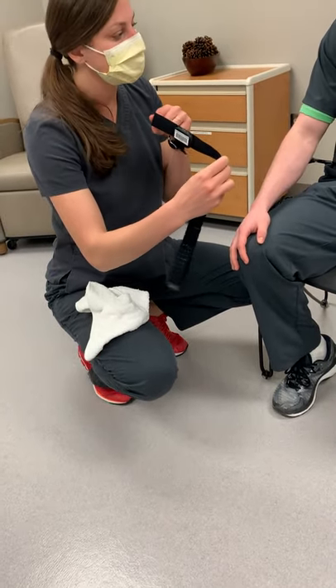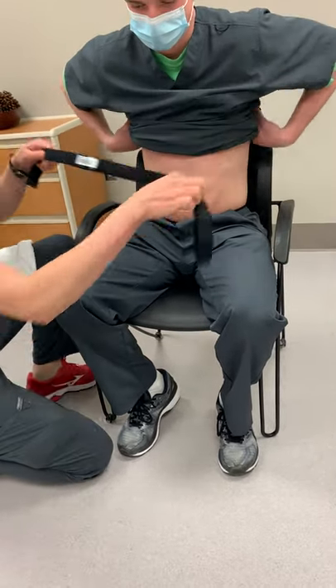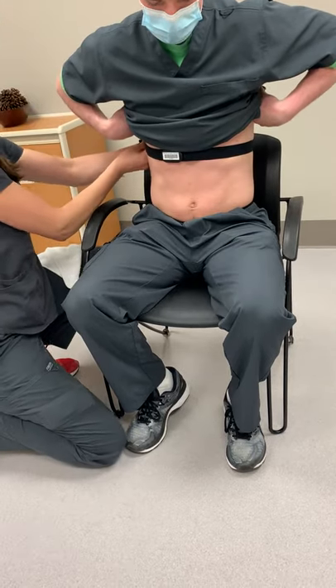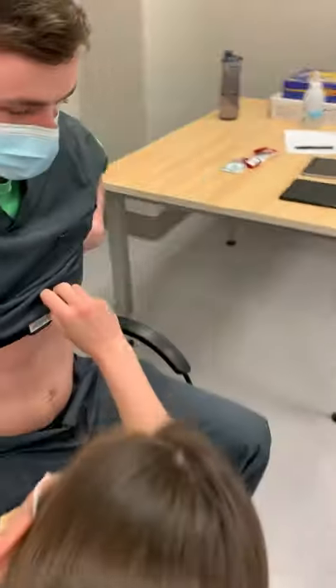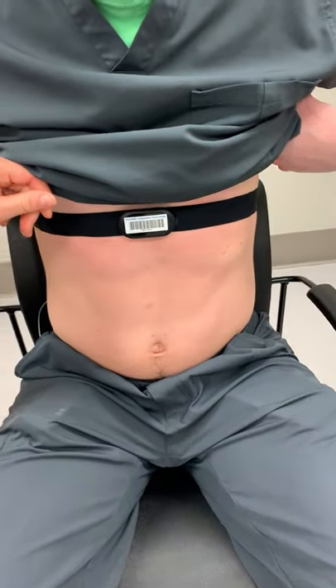Then we're going to take that and put it onto the patient. Austin, can you lift up your shirt for me? Thanks. Just reaching around and clipping it into place. And then we just adjust to make sure that that puck is centered in the chest.